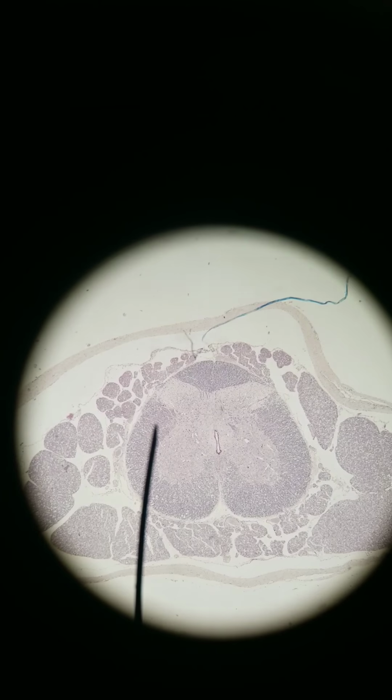So those are the basic structures of a spinal cord that you can see with our histology.